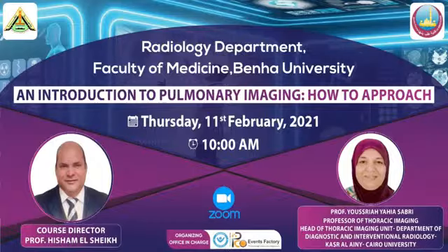plain x-ray I will not be able to differentiate. السي تي في بيقول لحضرتك ادي مش عارفة كام امبول صبغة، فلما تدي كام امبول صبغة الليجن هيبقى enhanced واللي حواليه مش هينهانس. الكلام ده كلام غالبا ما بيفرقش، يعني actually speaking مش هيبان. طيب ايه تاني ممكن بايه بقى نفرق؟ ممكن نعمل بيت، ده هيفرق. ممكن نعمل حاجات فانكشنال ايمجنج، نعمل ديفيوجن ار، ده هيفرق وهيبين الانفلتريشن. خلاص، يبقى بالموداليتيز العاديه اللي هي السي تي العادي حتى بالصبغه والبلين اكس راي انا مش هفرق.